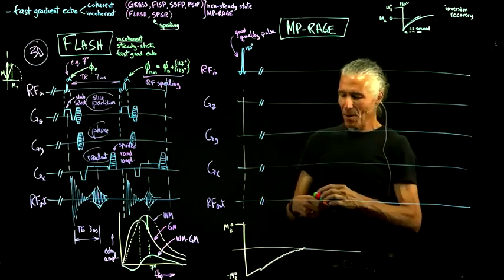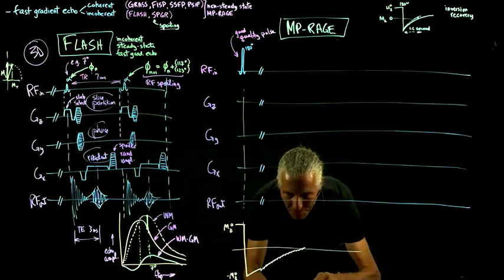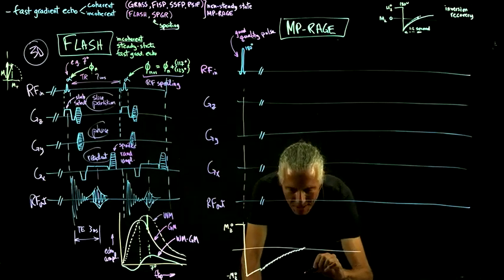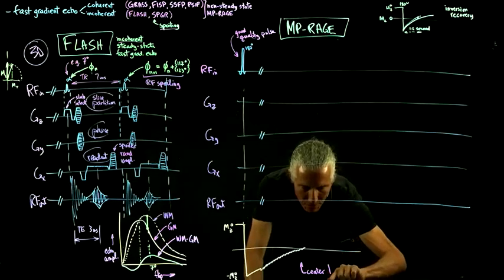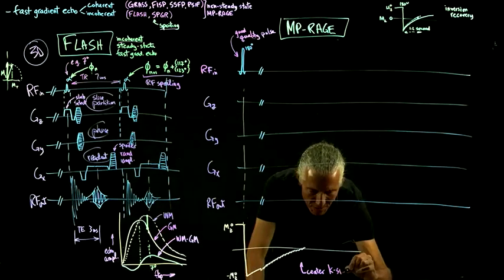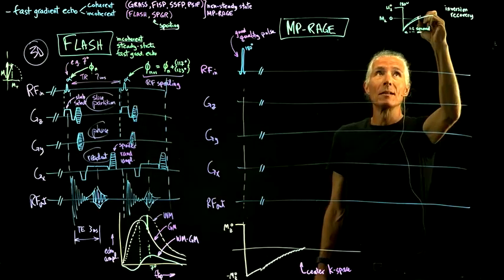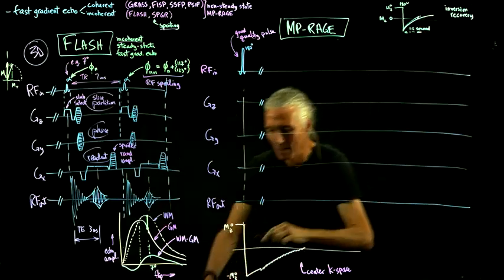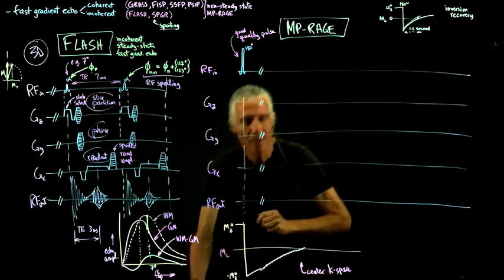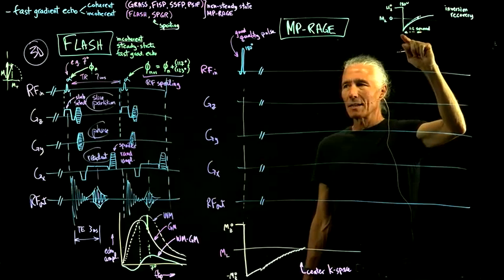And then the hope is, right at the center of K-space, because as you'll see in the homework, the center of K-space is very important for determining the contrast. And so you wait until you're hoping that the white matter got slightly above, this is longitudinal magnetization, slightly above 0, so that there's a signal, but the gray matter got exactly at 0.